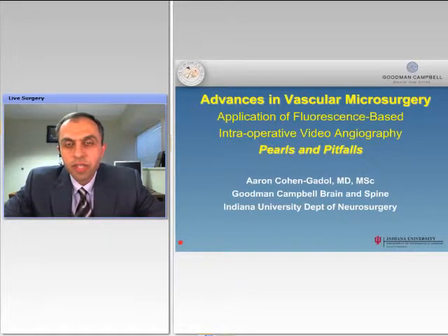This will be a discussion regarding advances in vascular microsurgery with some emphasis on description of application of fluorescent-based intraoperative video angiography. I'm going to call this fluorescence-based angiography from now on ICG, and that stands for indocyanine green dye. So what is this technology of ICG?